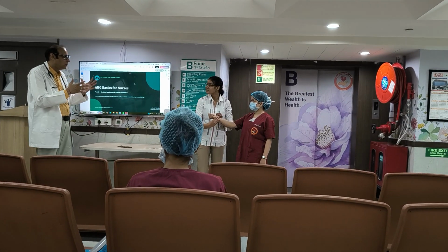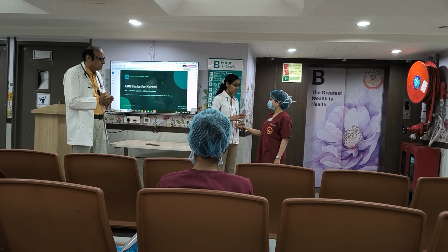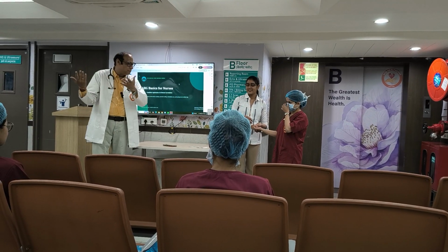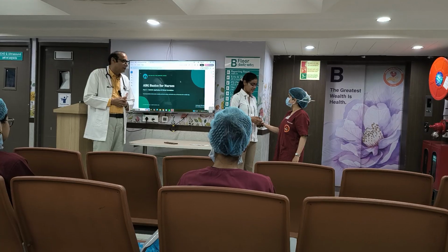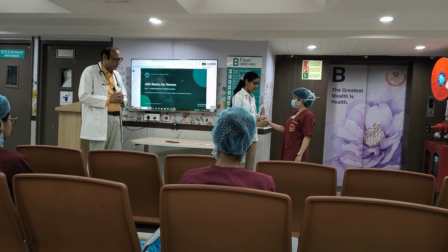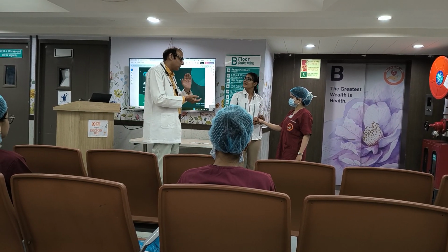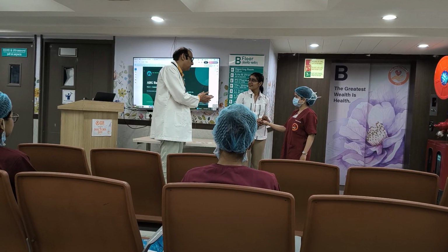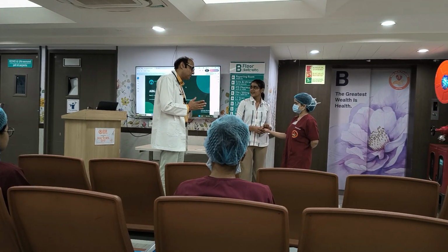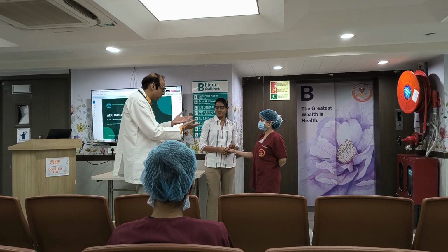Just explain with words. आप कैसे करेंगी बताएं आपको. Just one by one, in a step-wise way. Speak up, है ना? Because everyone is going to listen properly. First take permission. We are going to draw blood from your artery because this is ABG. So take permission from the patient. We focus on soft skills as well. Keep your voice very mild and ask in a very polite way.